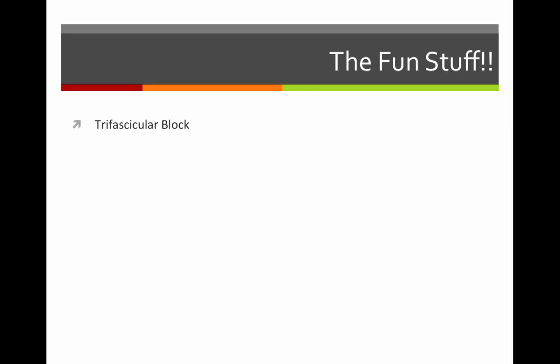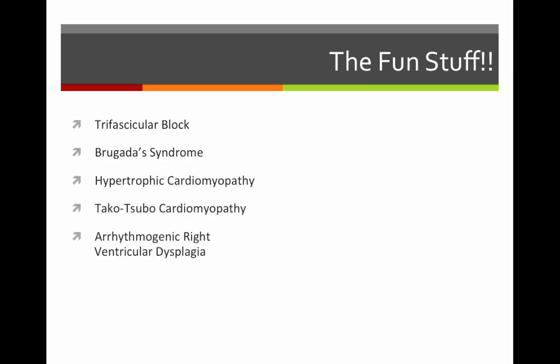We've talked about bifascicular blocks, right bundle branch blocks with hemiblocks, either posterior or anterior. So we'll talk about trifascicular block, which occur. We'll talk about Brugada's syndrome, a sodium channel syndrome that is, I guess, congenital, familial. We'll talk about our cardiomyopathies, including hypertrophic, Takotsubo, and arrhythmogenic right ventricular dysplasia or arrhythmogenic right ventricular cardiomyopathy, depending on who you're talking to.